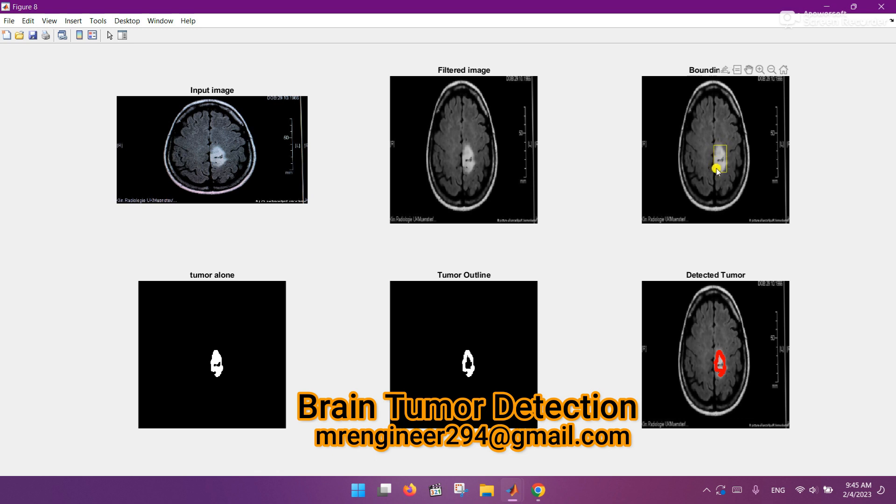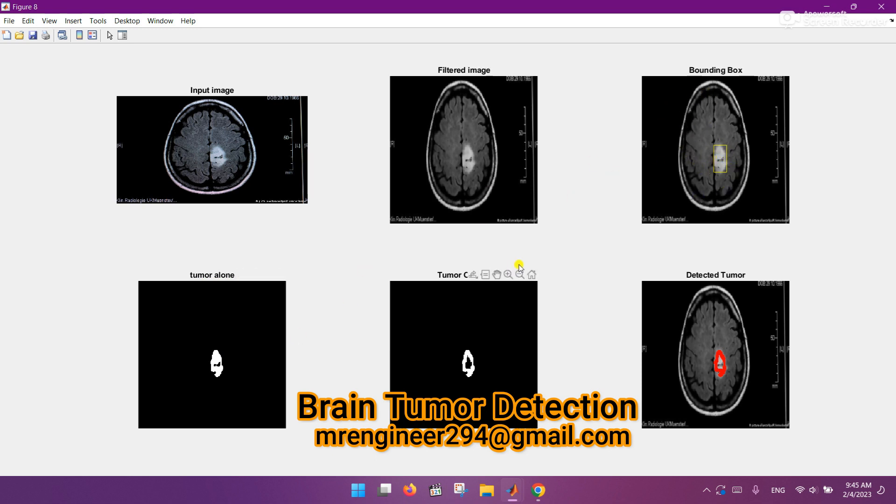And here is that tumor alone which is extracted from the whole brain. It is the tumor outline, and it is the final picture, a final highlighted area in which the tumor exists. This brain has a tumor inside. So in this way, you can do analysis on any random image of brain.